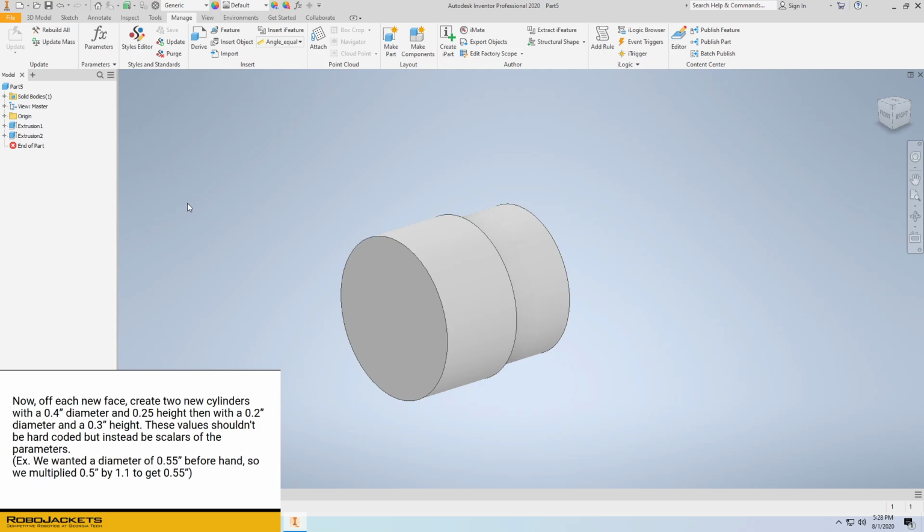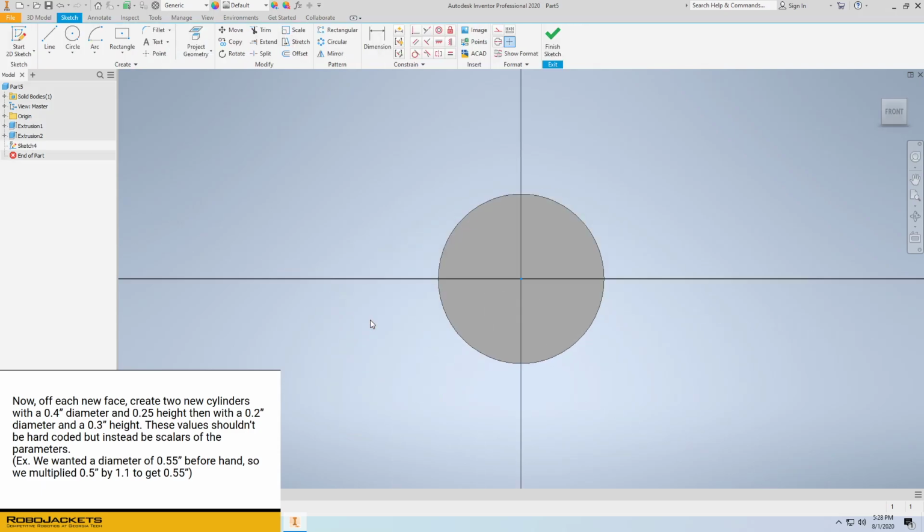So now we want to create 2 more cylinders off of the 2 we already have. To do that, we'll go ahead and create a new sketch off of this guy. Our specifications say with the current diameter, it should be 0.4 inches. However, we want this to update with changes to that main diameter. So instead, we'll say it's main dia times 0.8. This gives us the same value we wanted, but it's a scalar of the main diameter, so it will update with the parameter changes.